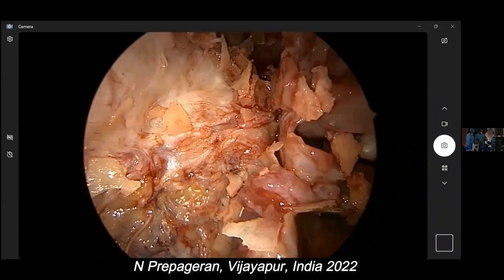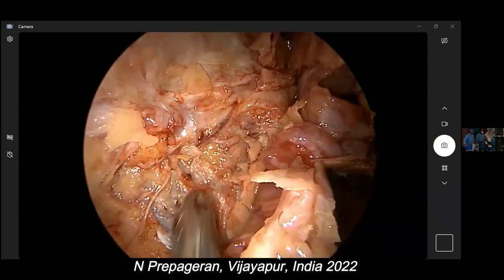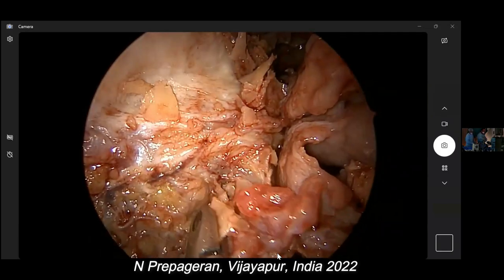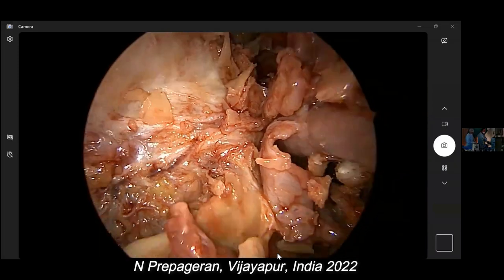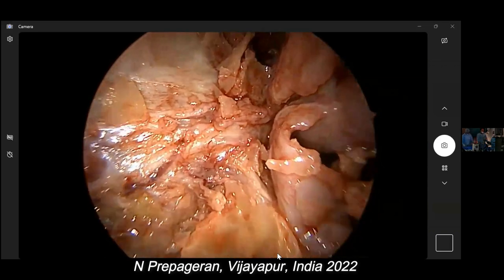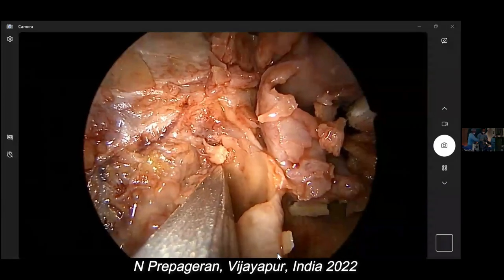Now I'm going to remove all the bone spicules so that we have a much better view. We need to remove a bit more, guys. This goes down. There's a mucosa here, which I need to remove as well. See how thick the mucosa is. This is the descending palatine. Now I'm going to open the whole area if I can.